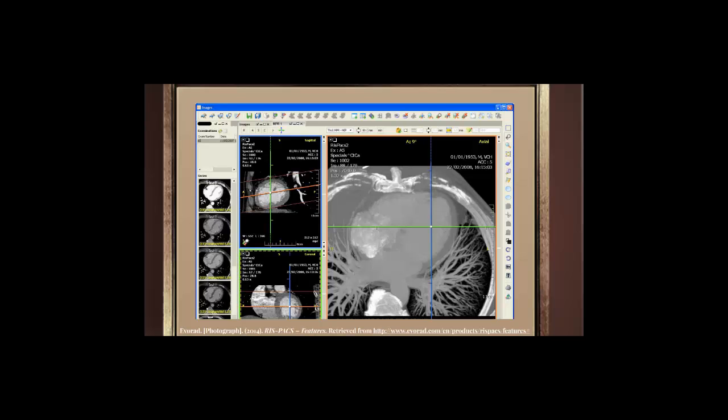If you look at it in the long haul, you're not having to have a contract for your chemicals, developer and fixer, that has to be replaced. You have a contract with film, and film is really expensive. So you invest in CR and DR imaging with a one-time fee up front, but there's no maintenance required.